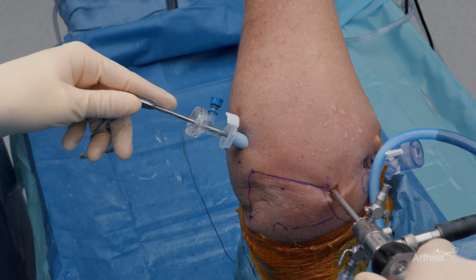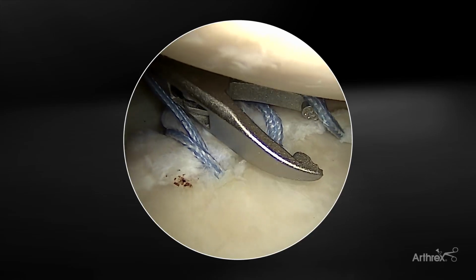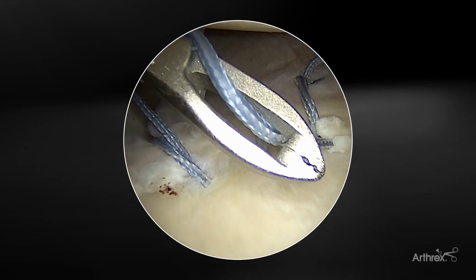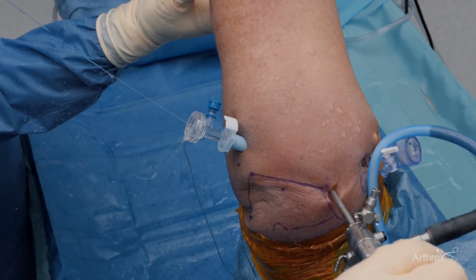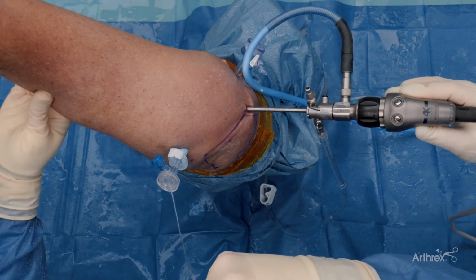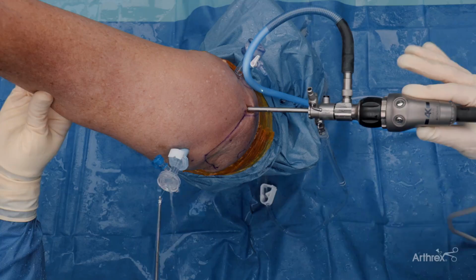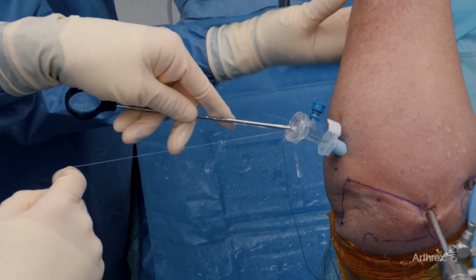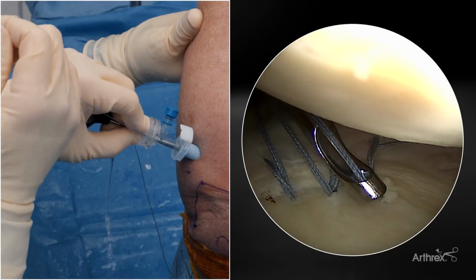What we're going to do is we're going to go in and we're going to tension these from the inferior-most anchor first. And so we're coming around, and again, this is our working stitch. We're going to pull this out. We're going to do this through the same cannula that we placed the anchor. I do still like to use the knot pusher with this as well. And so we are going to place this through our knot pusher so we can get some counter pressure down. So we're going to now slide our knot pusher in to provide our pressure here.